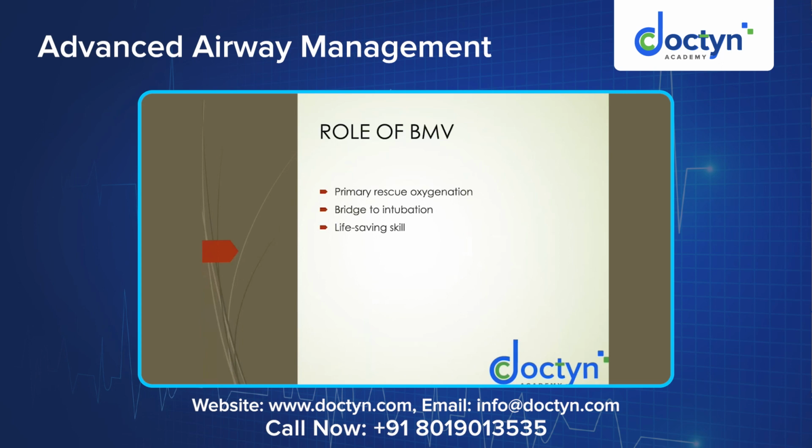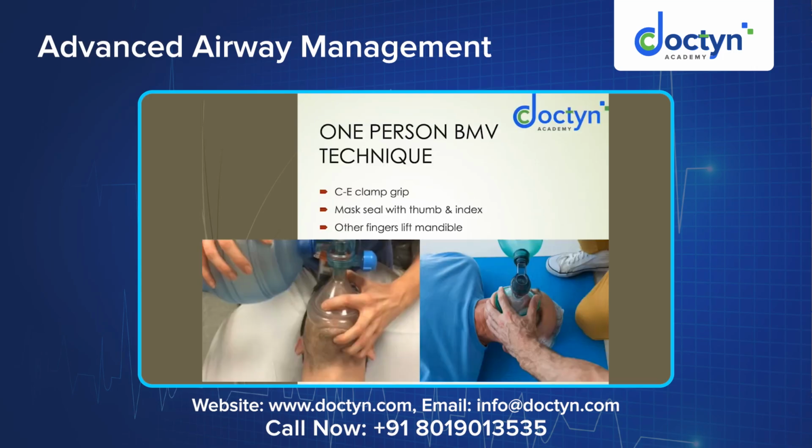So the role of bag mask ventilation is that it is always a primary rescue oxygenation. It is a bridge to intubation, and it is a life-saving skill. Till intubation, you can maintain oxygenation if you maintain bag mask ventilation effectively. There are two ways of doing it: one-person bag mask ventilation and two-person bag mask ventilation. In bag mask ventilation, the most important role is played by the mask itself.